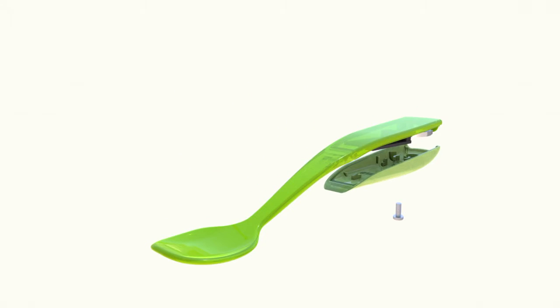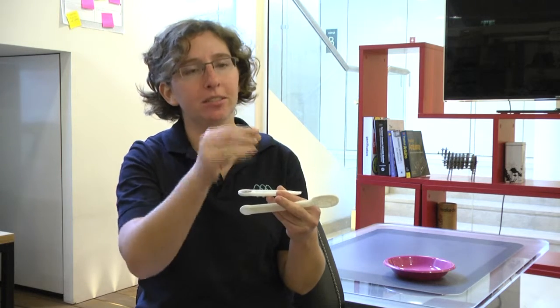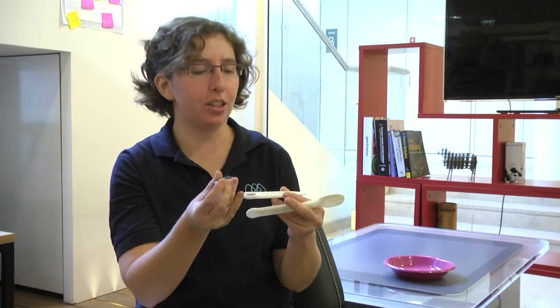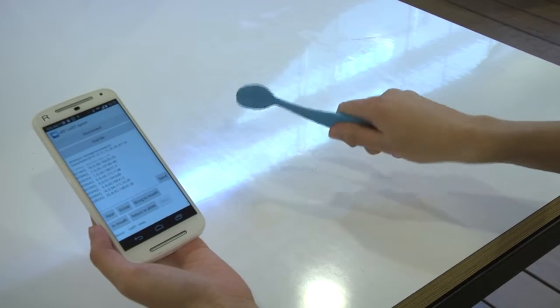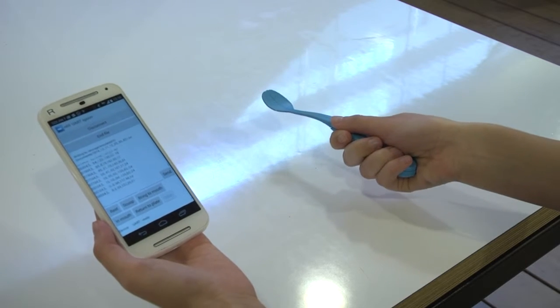Our research team has developed DataSpoon, a digital spoon that monitors self-feeding abilities and provides dynamic visualization to a parent or therapist. The spoon contains an Arduino clone, which has a 9 degree of freedom motion sensor and onboard Bluetooth communication. The spoon can measure subtle motions of the hand in real time and communicate them to an Android smartphone.